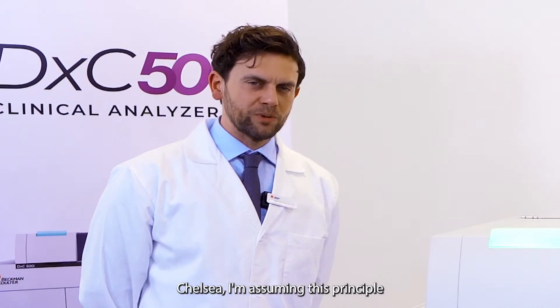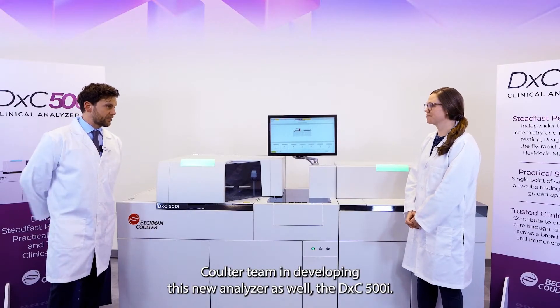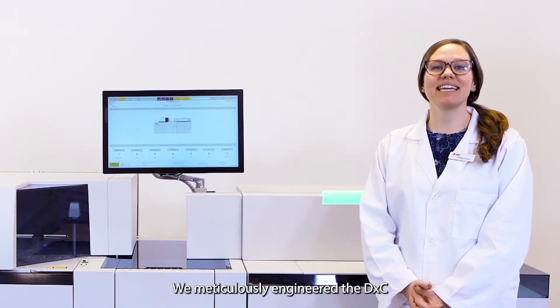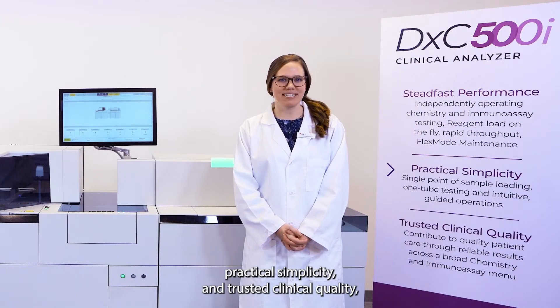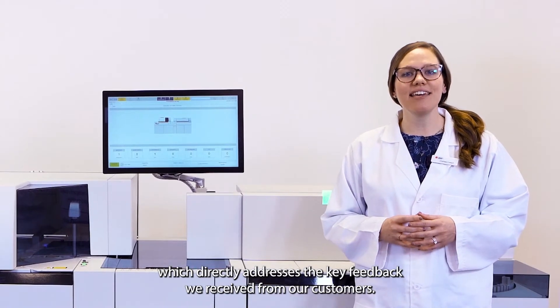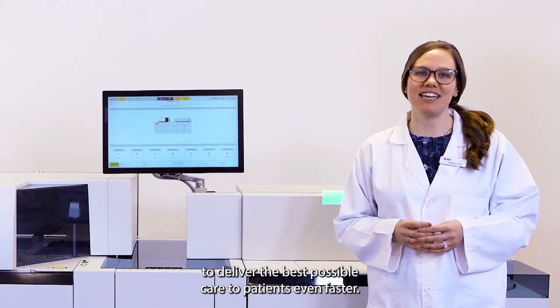Chelsea, I'm assuming this principle of 'customers talk, we listen' has been used by the Beckman Coulter team in developing this new analyzer, the DxC 500i. That's right, Alberto. We meticulously engineered the DxC 500i analyzer for steadfast performance, practical simplicity, and trusted clinical quality, which directly addresses the key feedback we receive from our customers, empowering you with actionable insights for clinicians to deliver the best possible care to patients even faster.